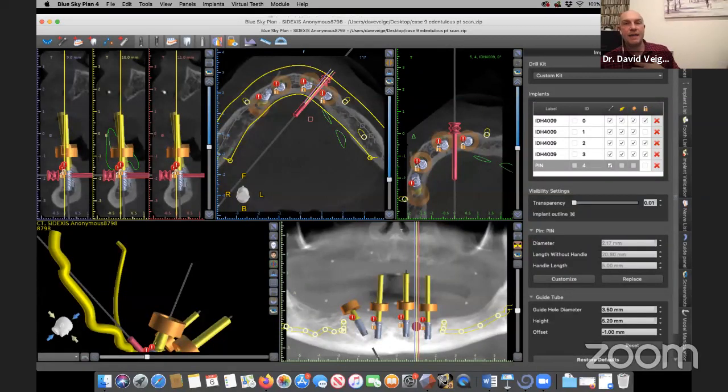What I find working in my own hands is that these surgical guides are extremely accurate. It's hard to tell because I'm not scanning the patient and overlaying the data of my plan onto what I actually did. But I do know that when I plan the case and I want the implant just anterior to the anterior wall of the sinus, and I go in there, my surgical guide is completely obscuring my view. I drill that osteotomy, I take my X-ray, and it's exactly where I wanted it to be.